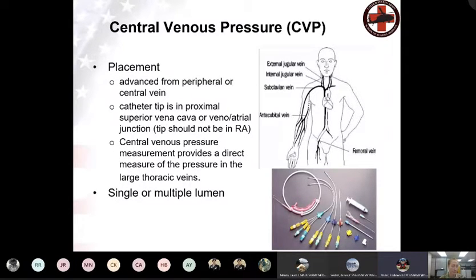Central lines, you're able to give more medications without damaging the vessels. Like you can give Levophed or norepinephrine or epinephrine. You can give potassium, and none of these will possibly injure the vein wall. You can monitor CVP with the central line. It's a great access if you don't have arterial, so you can actually draw blood from that as well. You can give mass infusions through it. It's just basically like a big funnel.